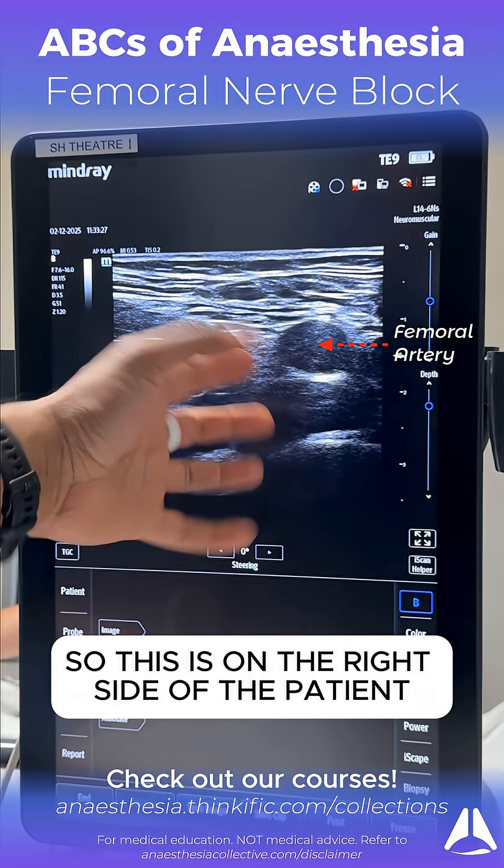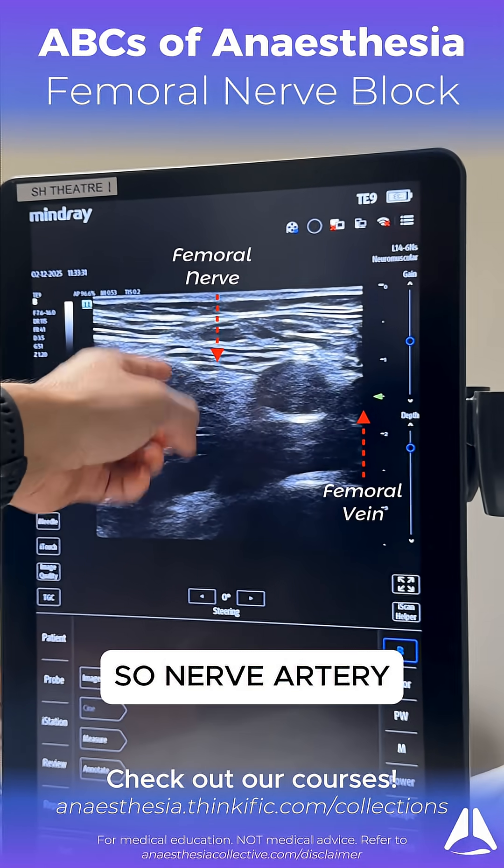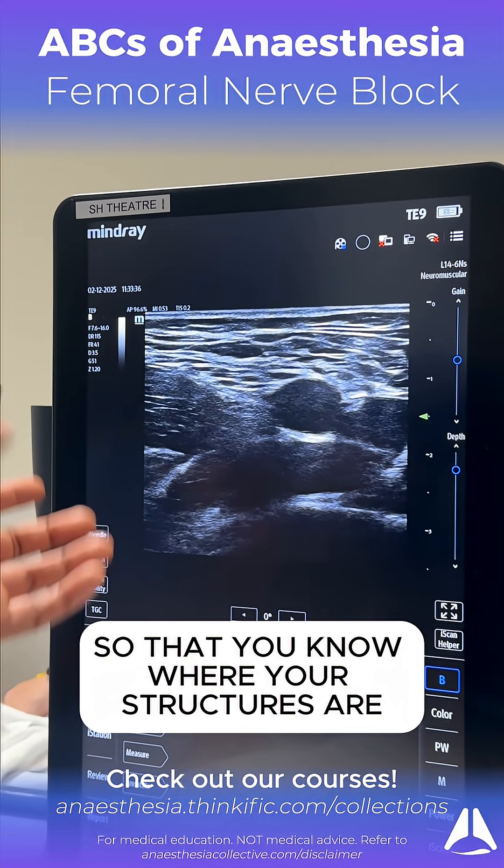And here we have the femoral artery. This is on the right side of the patient. So femoral artery here, and nerve, and the vein there. So the mnemonic is NAVEL — nerve, artery, vein, and then lymphatics — so that you know where your structures are.